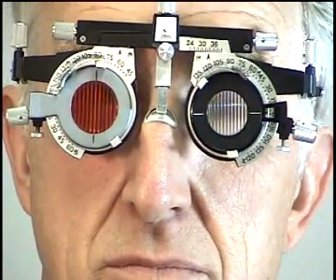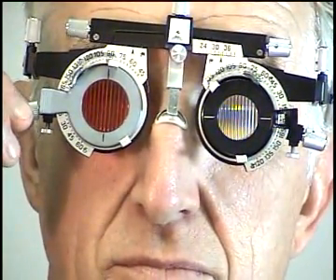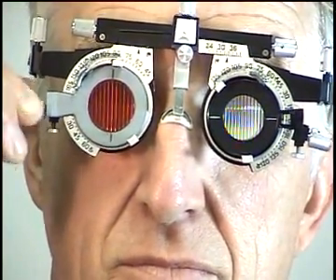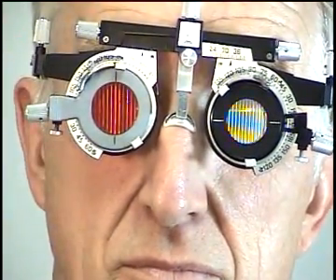Can you please rotate the rod in white for the two lines? I see two lines. I can't tell if this is the right line — I see two lines, but it has to be a little bit.